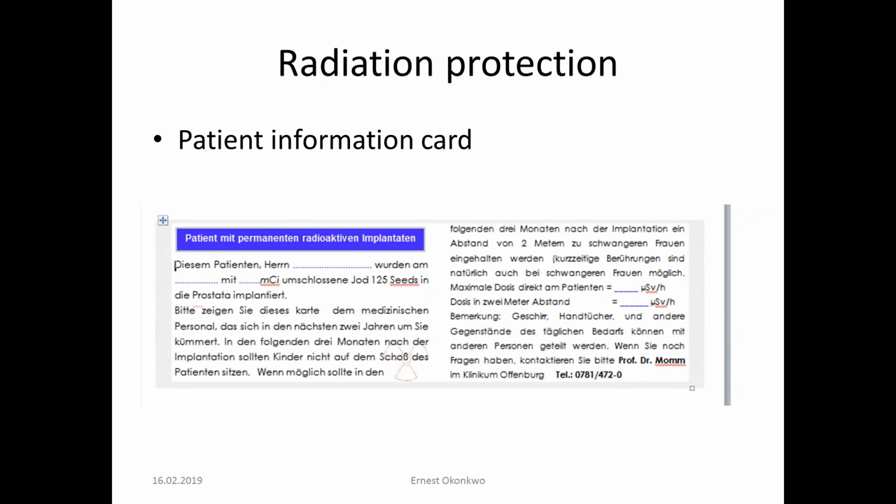the document meant. So it's important that your patients carry along this information card as well, so that in case of anything, the people involved should know what activity they received, when they received that activity, and that there's no danger to the public.